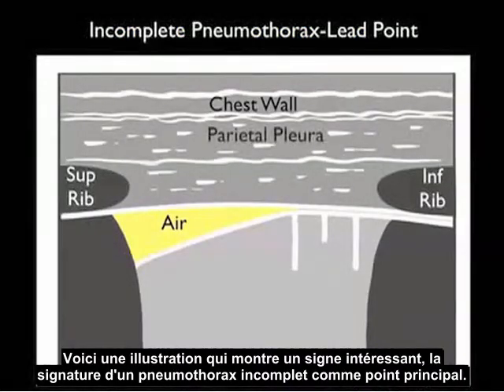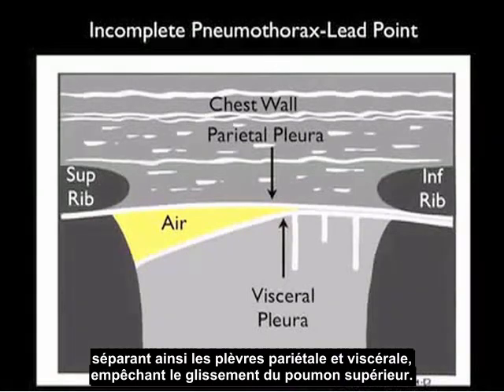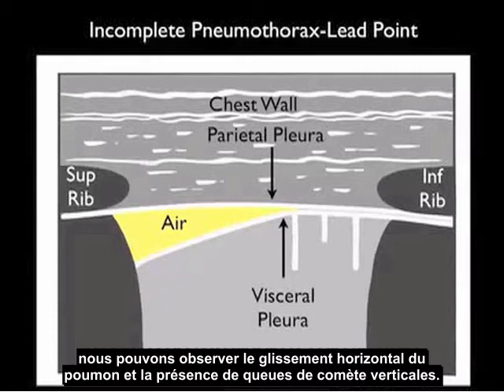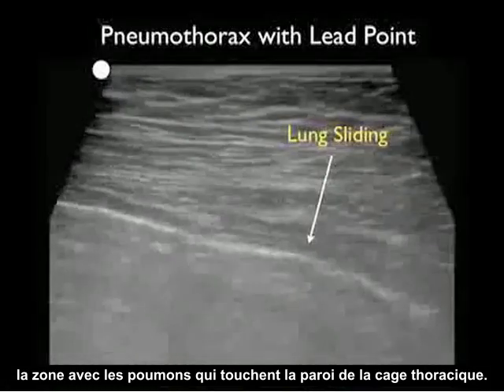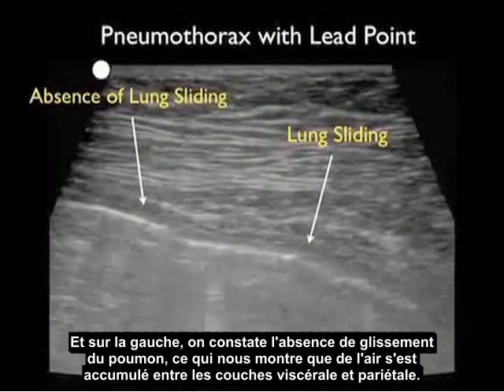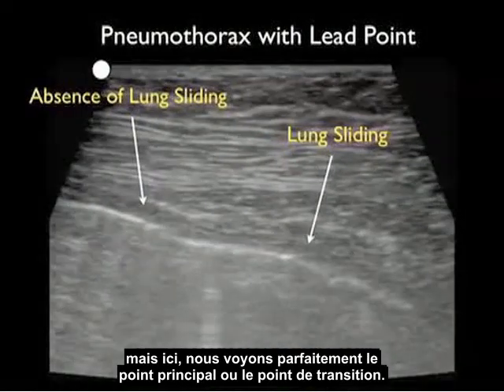Here's an interesting finding — the signature of an incomplete pneumothorax known as the lung point, or lead point. We see an incomplete pneumothorax with air collecting superiorly, splitting the parietal from the visceral layers and causing an absence of lung sliding in that region. However, where the lung comes up against the chest wall inferiorly, we see the presence of horizontal lung sliding and vertical comet tails. Here's an ultrasound image showing the lung point — lung sliding to the right where the lung touches the chest wall, and absence of lung sliding to the left where air has collected — confirming this is an incomplete pneumothorax.